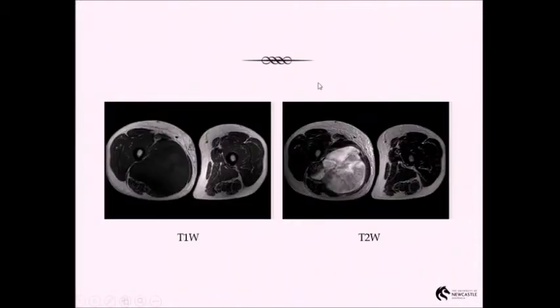And again, just going back and looking at some musculoskeletal cases. So this would be in the thigh. So femur, again, bright signal from fat, and then we have more dense bone, so we don't get much signal there. We can see signal from subcutaneous fat, and we can see different muscle groups. You can actually see how fat infiltrates these muscle groups.